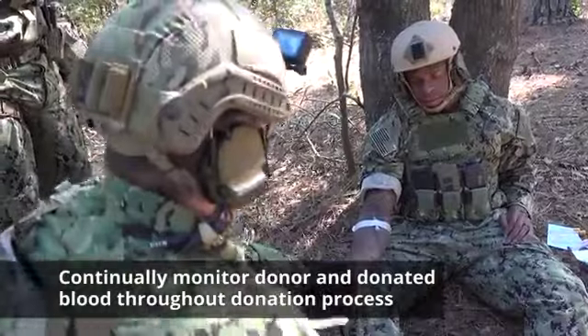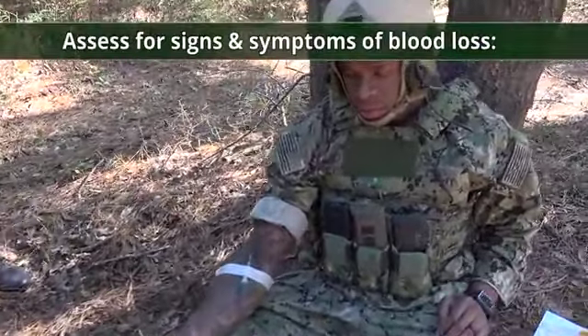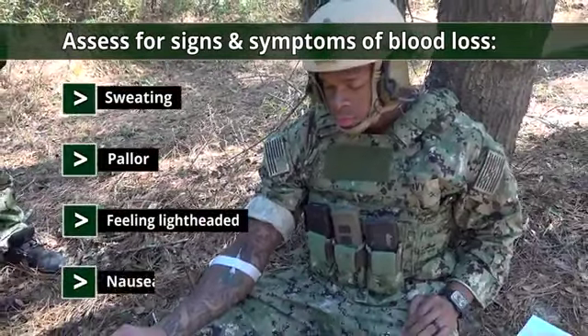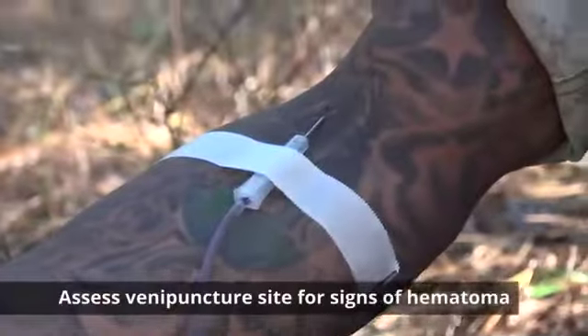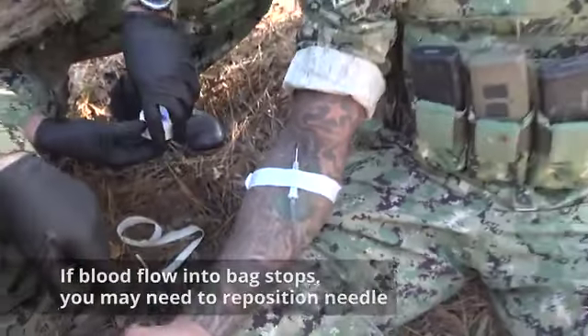Continually monitor the donor and the donated blood throughout the donation process. Assess the donor for signs and symptoms of blood loss: sweating, pallor, complaints of feeling lightheaded, nausea, etc. Assess the venipuncture site for signs of hematoma. If blood flow into the bag stops, you may need to reposition the needle.